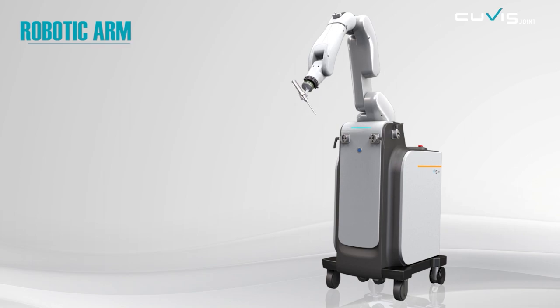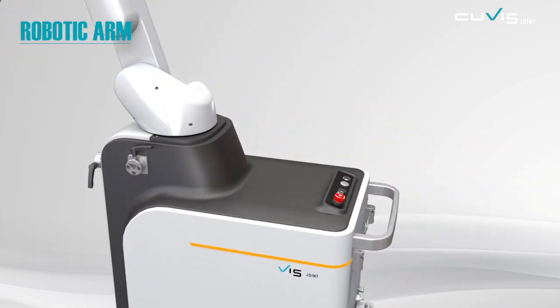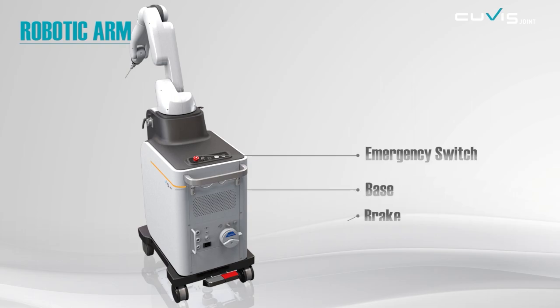QVIS Joint is divided into two parts: a robotic arm and the main console. The robotic arm contains a manipulator with a high degree of freedom, designed for automatic cutting, and a base that controls the robot.